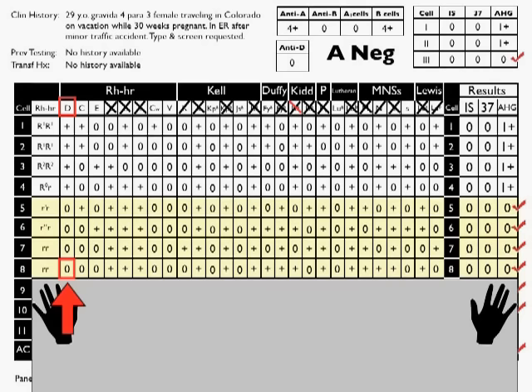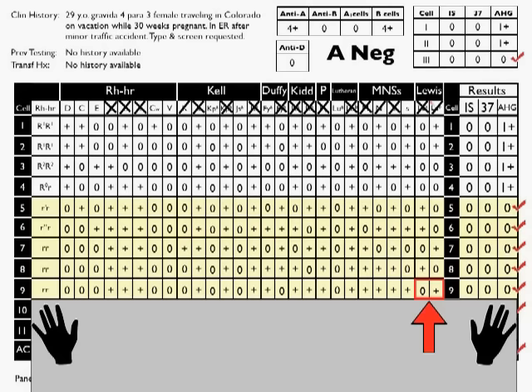Okay, cell 9. Here's another double dose rule out for Lewis B, put another slash. We have single doses for both big S and little s, no rule out. Single doses for big M and big N, no rule out. We've already ruled out Lutheran B, already ruled out P, already ruled out both of the Kidds. Oh, good. Here we have a double dose rule out for Duffy A. So we put a single slash through Duffy A. And the rest of this is going to be pretty boring. Nothing to do with any of the Kells that we haven't already done. Onto RH, nothing for V, CW. And we've already done F and little e and little c. And again, these are RH negative donors, so no D to rule out.